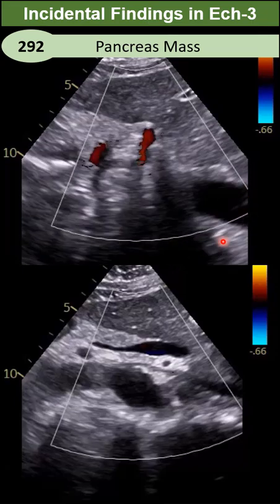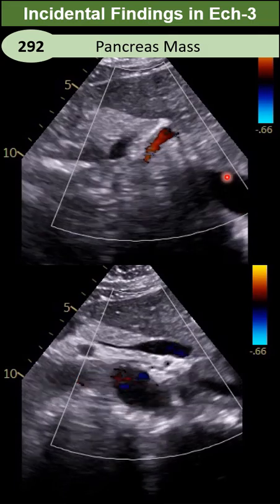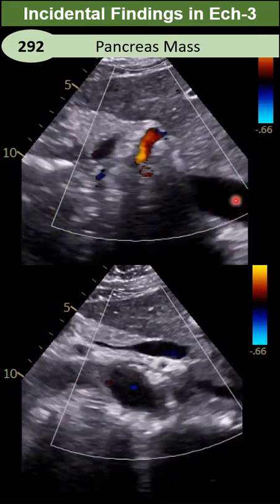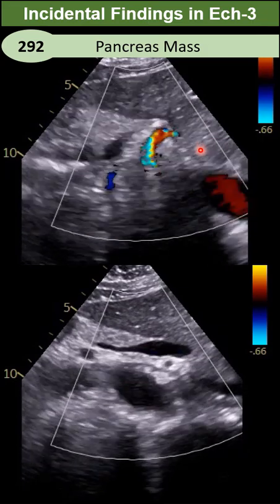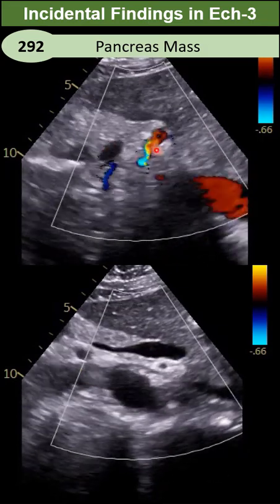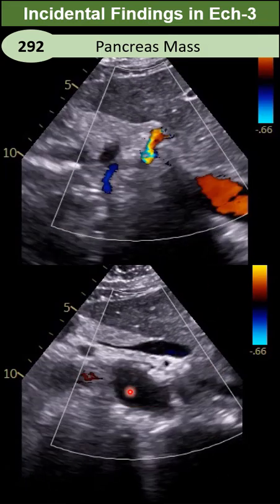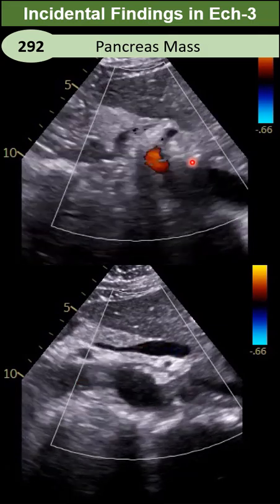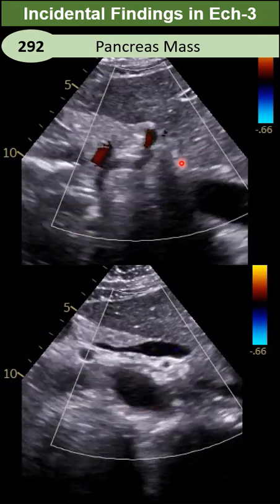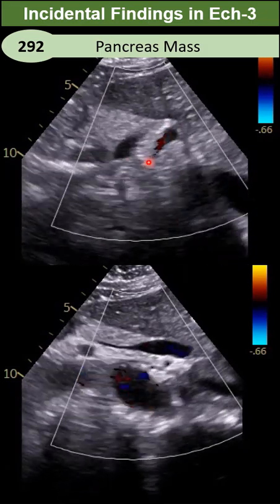Here we have the aorta, as you can see, cylindric shape, pulsation, and color Doppler, and the branches, the most important branches, the first branches being celiac and then SMA. This is a characteristic feature of the aorta in longitudinal, and we can appreciate the pancreas at this level. You can see this hyperechoic border is our pancreas.